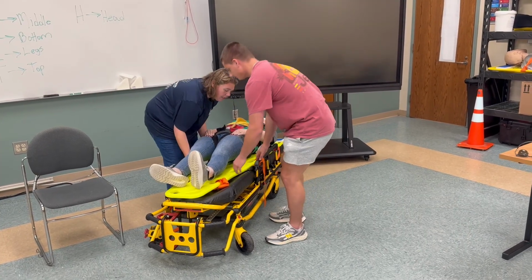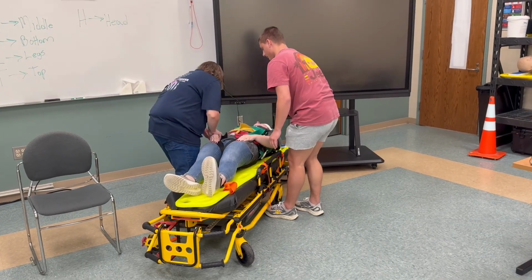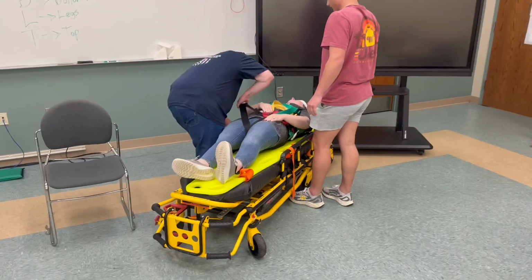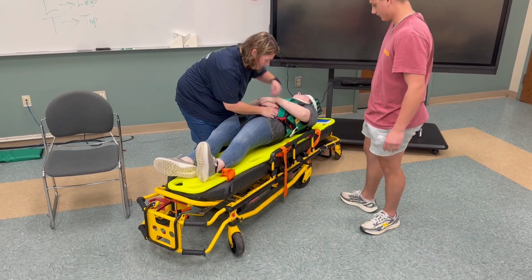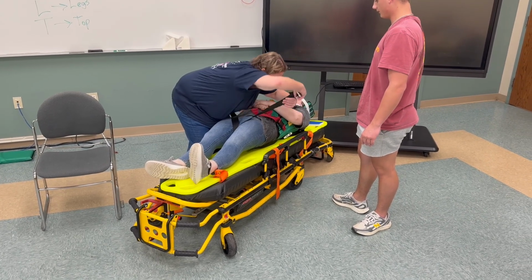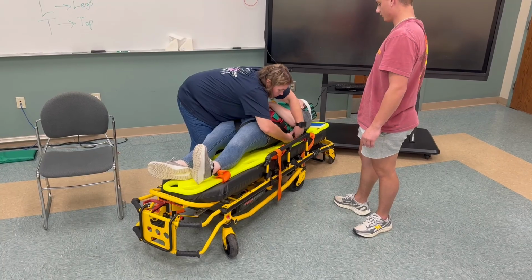So after we're on here, you can loosen the leg straps a little bit so that the patient is more comfortable. And then we're going to continue to secure her to the backboard.